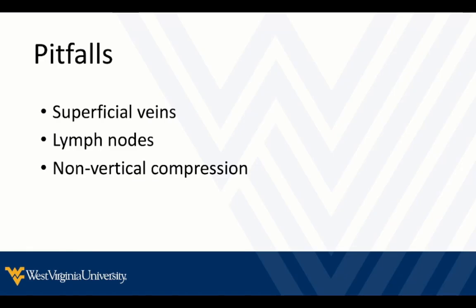Okay, a few pitfalls. Things to look out for. Make sure you're looking at the deep veins. They're always going to be touching arteries. Don't get fooled by looking too superficially and focusing on superficial veins.